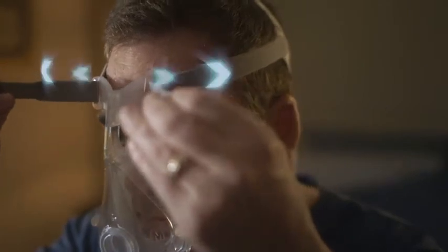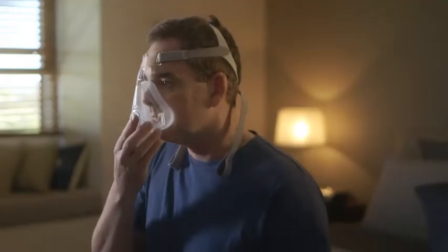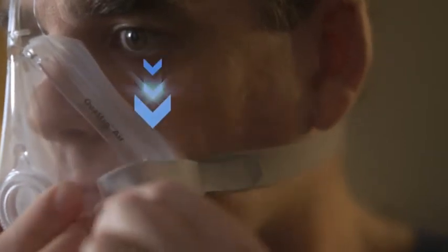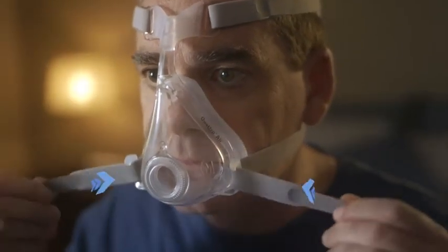Now adjust both fastening tabs on the mask's upper headgear straps at the same time, until the mask is stable, but not too tight. Holding the mask to your face, bring the lower straps around and under your ears. Then loop into the lower hooks on the frame. Now let's adjust the loose lower headgear tabs, tightening both tabs evenly so the mask feels comfortably in place on your face.